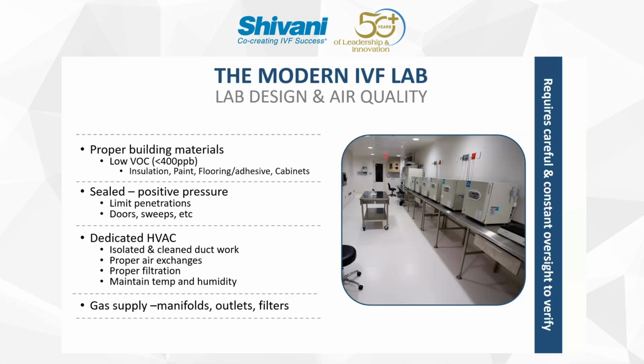So we can talk a little bit in depth about some of these things, and it will vary by region in terms of cost, as we've mentioned, and some other local considerations. And then in terms of air quality, this also carries over to the gas supply, in terms of the gas tanks being a potential source of VOCs, and some filters and steps that can be taken to address those.